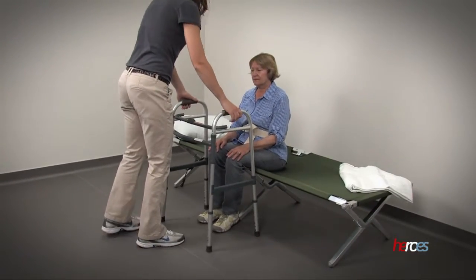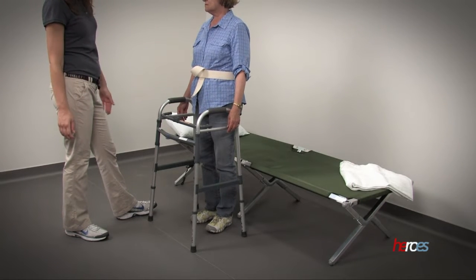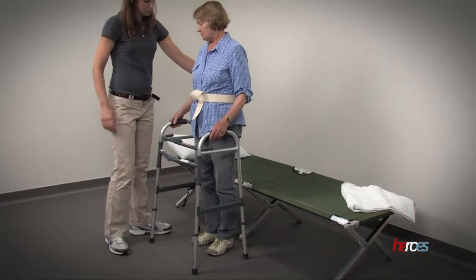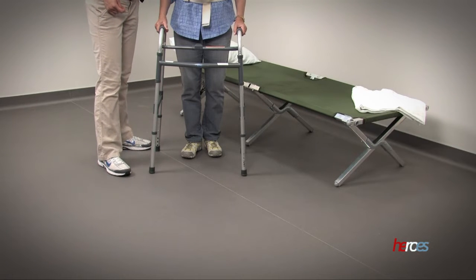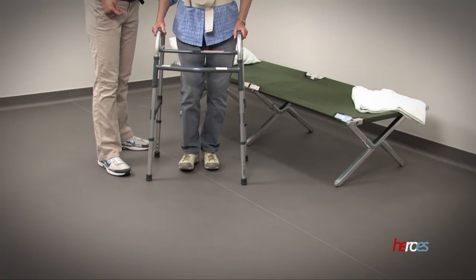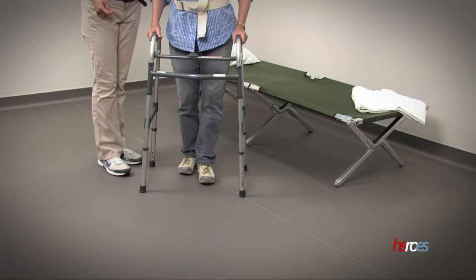When using a walker, make sure that it is held at a comfortable distance in front. Adequate room should be left to step forward, but not so much room that they have to lean over to reach the handles. If the individual has a weaker side, first inquire about how much weight they are able to bear through their affected limb. Instruct them to always keep the weaker side inside of the walker by advancing the walker and then the weaker side.